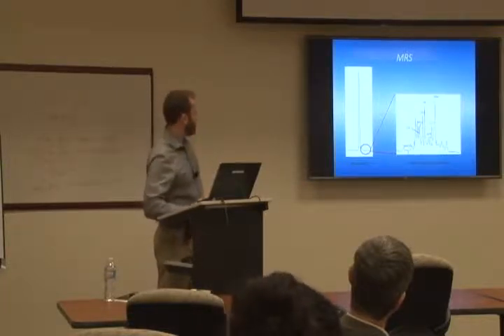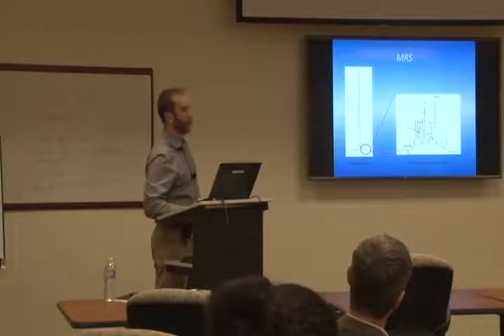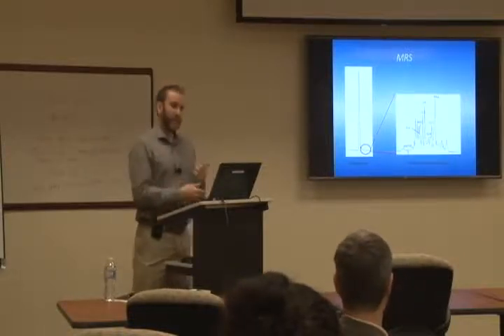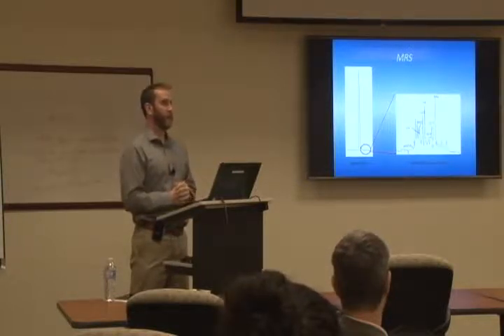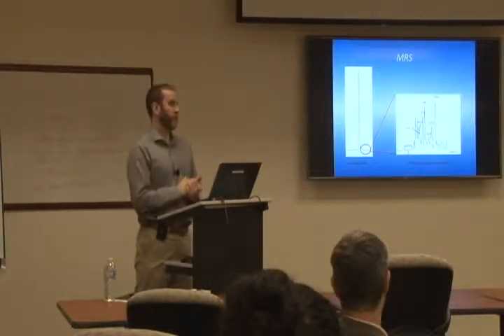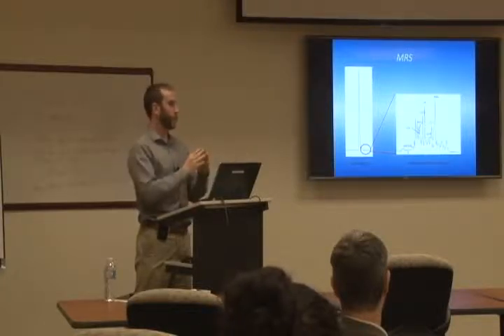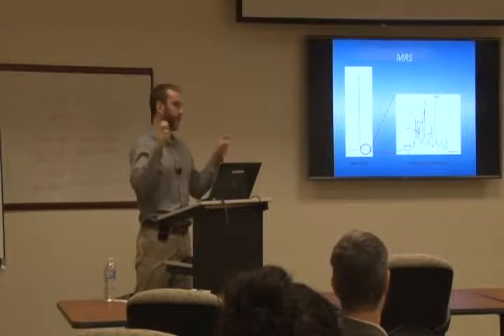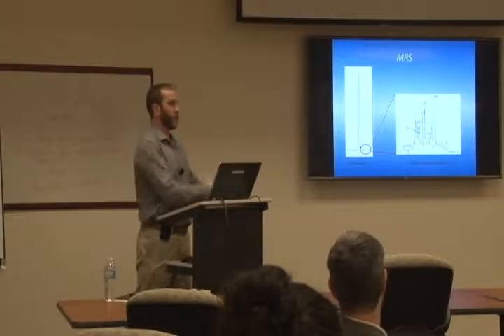So they are still a little bit separated, but there's going to be a little bump just on the side where glutamine is. Some people claim to be able to separate it, and you can try. Whenever you do a spectroscopy study at 3T, it makes sense to report glutamate and glutamine individually, and then also report them together as GLX, is what we call it. So you can do both, and then you can extract conclusions from that.